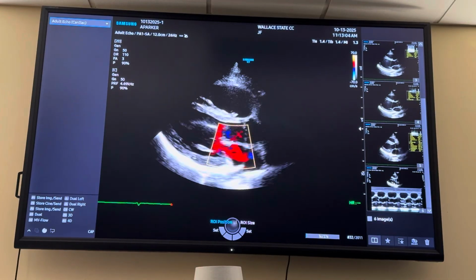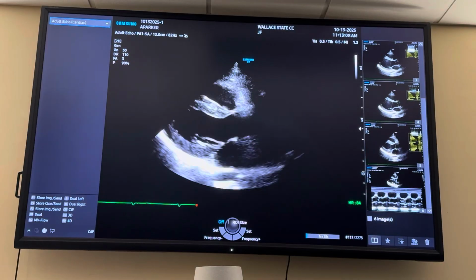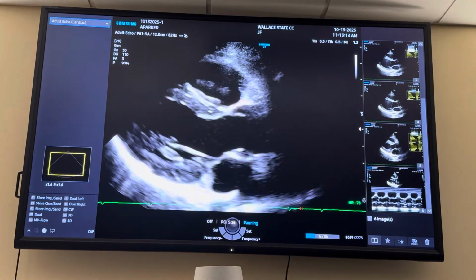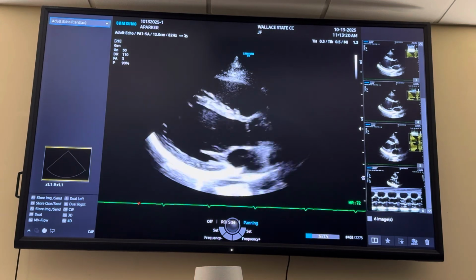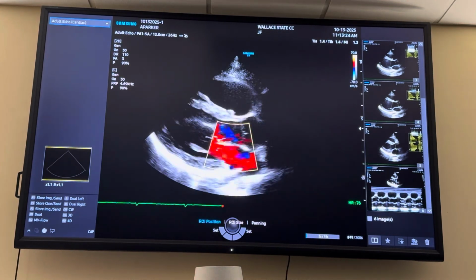Okay. Is it okay to get the mitral valve and the aortic valve in the same color box? To me, and I don't know how Ms. Flack feels about this, this is how I do it normally. If you have it zoomed in, I would feel like that's okay. Do you feel like that's okay, or do you want them to do it separate? No, it's okay. Okay. But I don't know, it's kind of a fine line here.